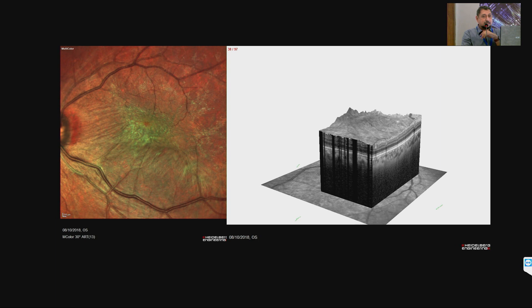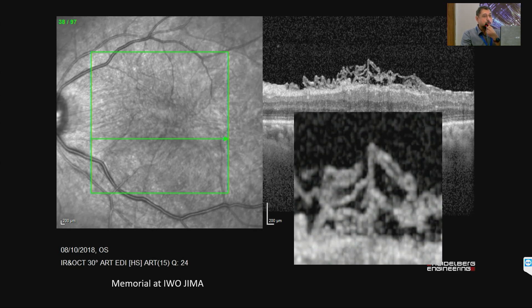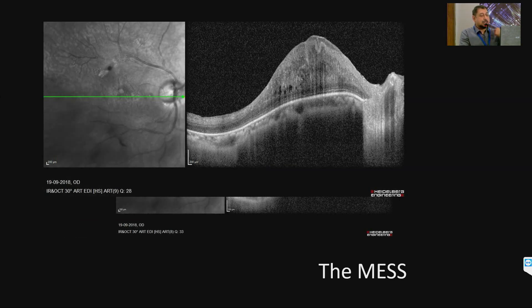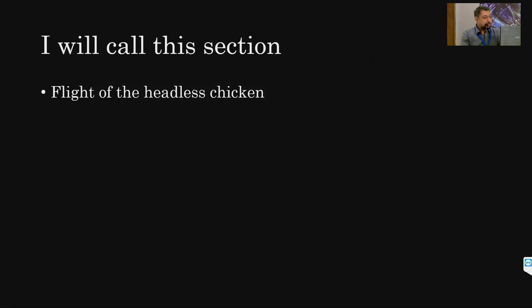This section is called 'the flight of the headless chicken.' A DME-type lesion showing inside what looks like a headless chicken appearance — a small circle inside the cyst resembling fibrin. This particular patient turned out to have a diagnosis of PAMM, with ferning visible in the en face imaging and hyperreflective middle layers on both sides.